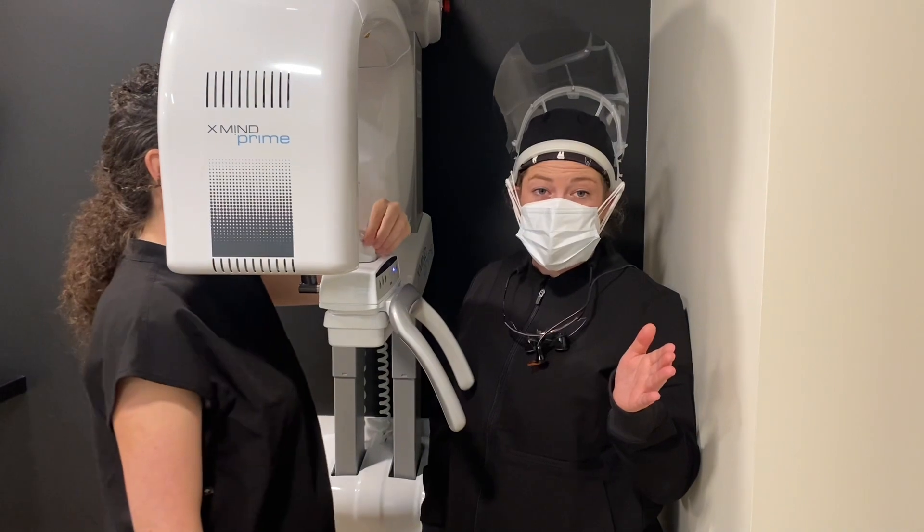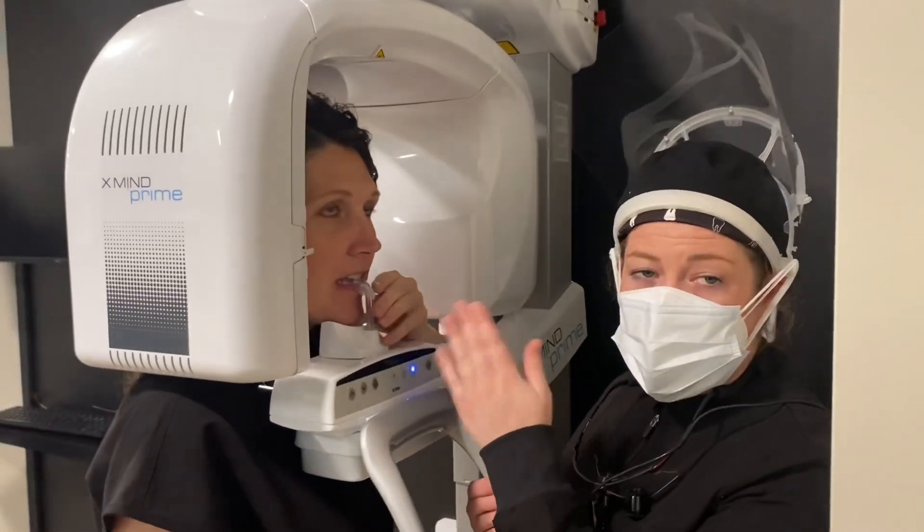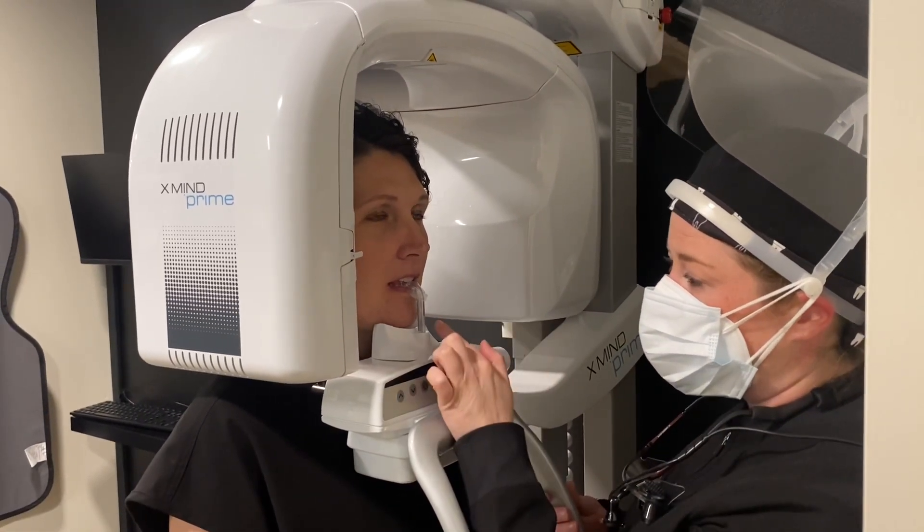When placing your patient in the panoramic machine, have them step into the machine and bite on the bite stick. This is where you're going to get your mid-sagittal plane in line with the stick.